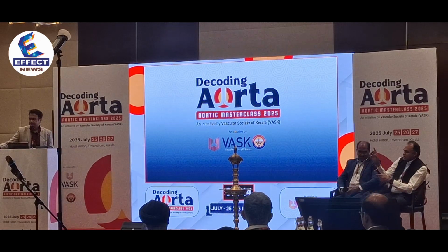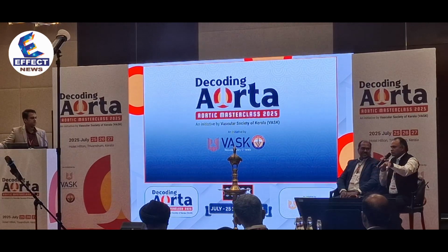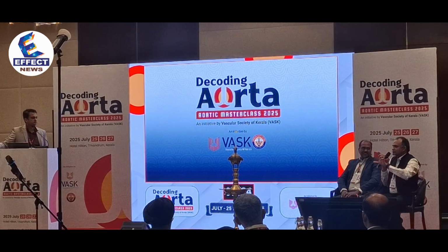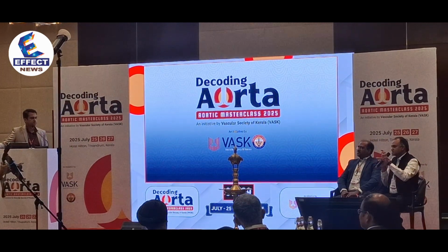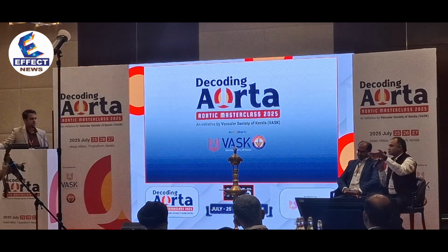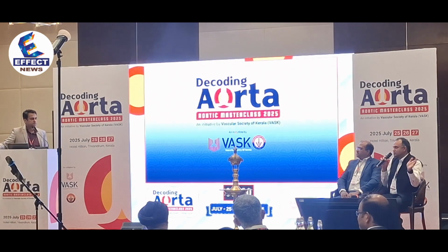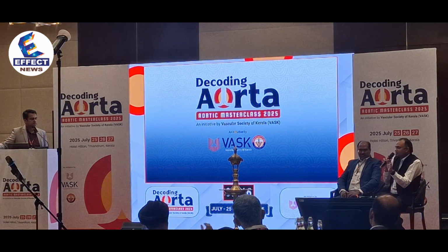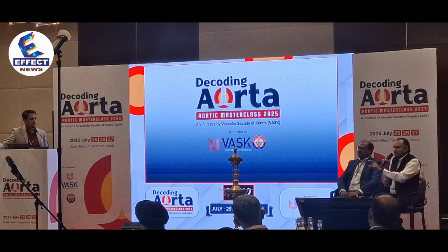So we end the session. Thanks for the talk on the whole thing, gradient. What Robbie sir said, don't upgrade the software, but you need to have a minimum requirement of the system: the processor, the memory, and in certain cases the acceleration card, the graphics card, which gives you a GPU, the graphics processing unit. So do look into that. Otherwise, if you have a bad experience, you tend to blame the software for it. So look into the system requirements first.